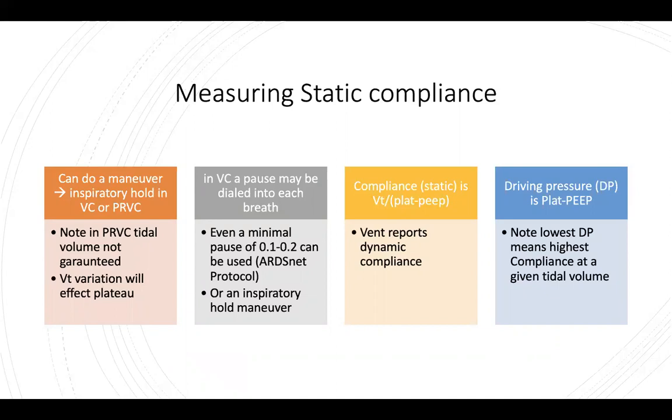And this is actually what they used in the original 2000 ARDSNet study to measure plateaus routinely during low tidal volume lung protective ventilation. Or you can do that longer plateau with the inspiratory hold maneuver, and once in a while it's worthwhile to do that and confirm that that is an accurate plateau with a short pause.